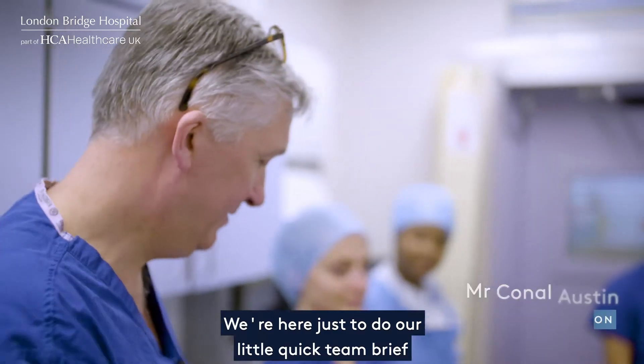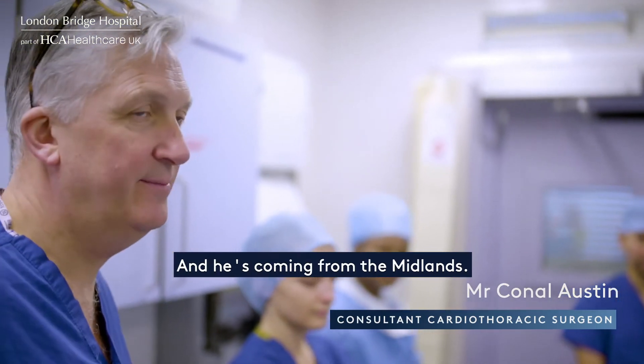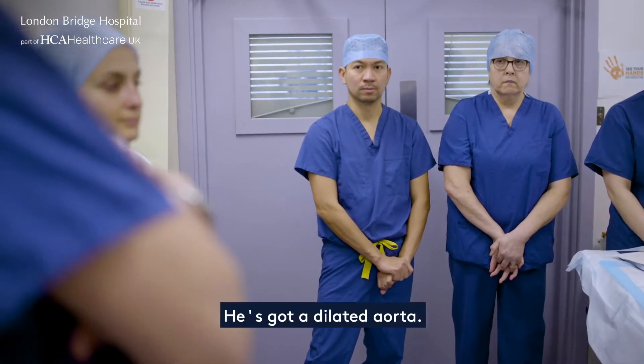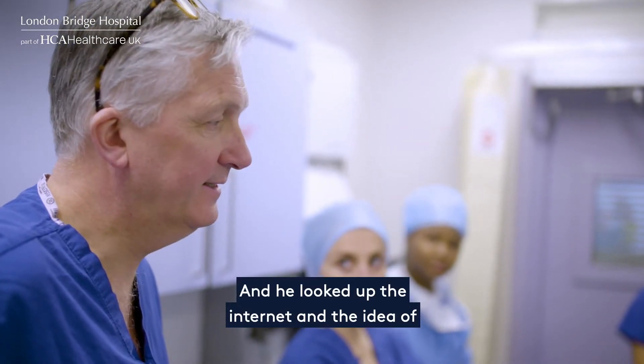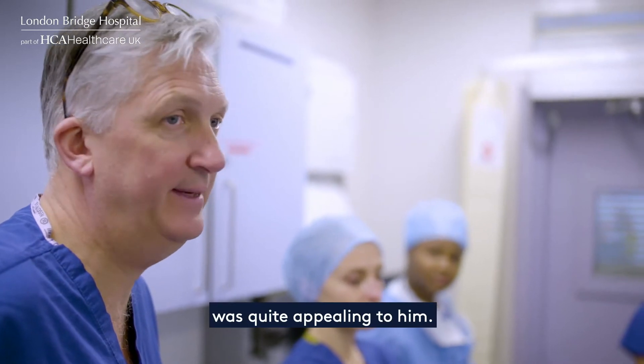We're here just to do our quick team brief on our patient who's 47 years of age and he's come from the Midlands essentially as a self-referral. He's got a dilated aorta — his aorta measures 5.2 centimetres — and he looked up the internet and the idea of an external aortic root support system, PEARS, was quite appealing to him.